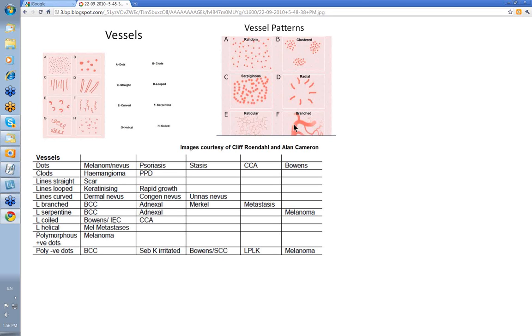The patterns probably most important to us are the branched pattern in BCC, but also in any rapidly growing tumor. The serpiginous dot pattern that you see in clear cell acanthoma, and this radial pattern that you'll see in some adnexal tumors and sebaceous hyperplasia.